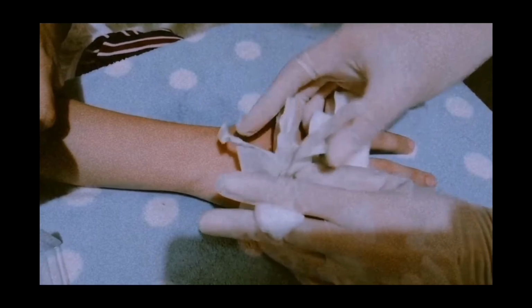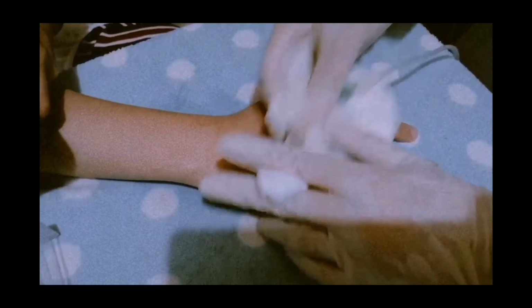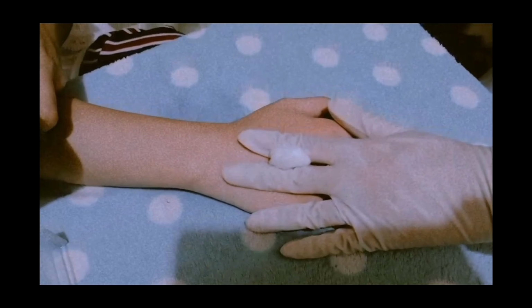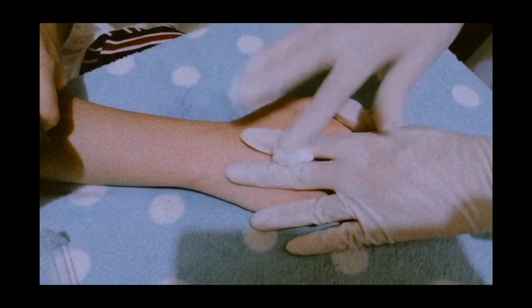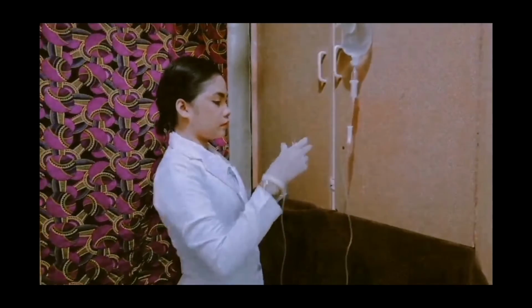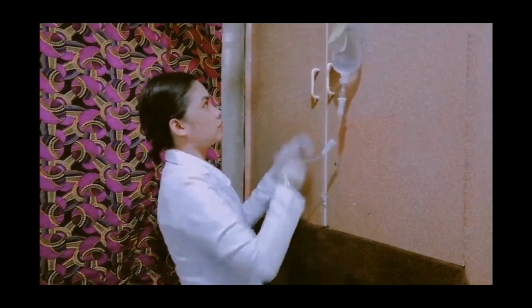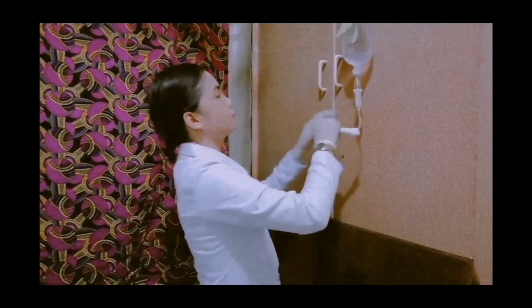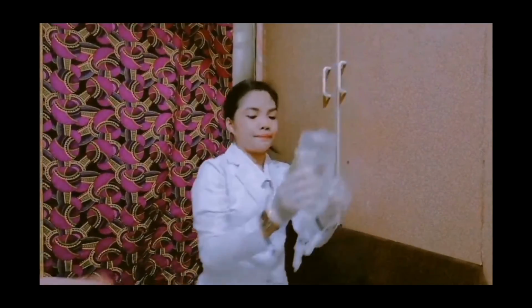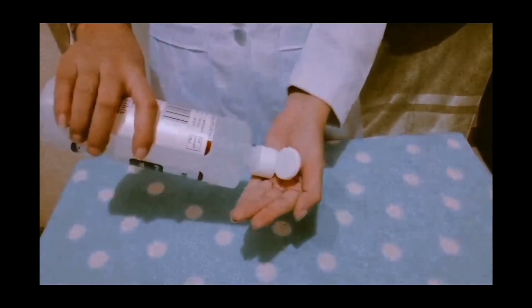Pulling out in the line with the vein prevents injury at the vein. And after that, immediately apply firm pressure at the site using the swab for 2 to 3 minutes. Pressure helps stop the bleeding and prevents injury at the vein. Next is to discard used supplies appropriately. Remove gloves and wash hands. The dressing continues the pressure and covers the open area in the skin, preventing infection.